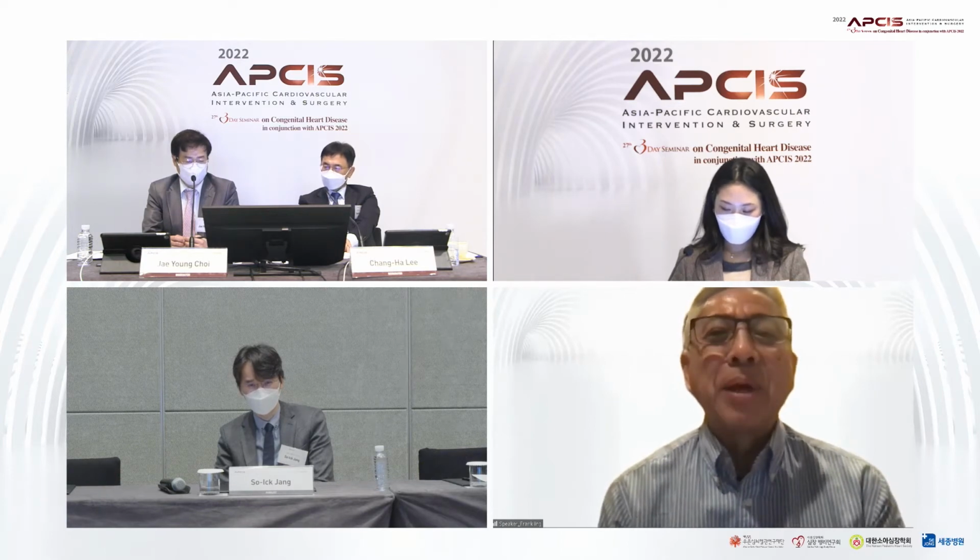But I thought what Shingo said earlier was important. When you have these complex stenoses, you have to make a plan that spans a long time. He mentioned earlier that when you go to surgery and do something preemptively, I would just say the kid's going to come back to the cath lab in 2 months. You schedule for them so that you already know that.